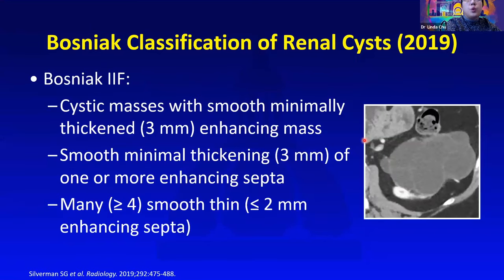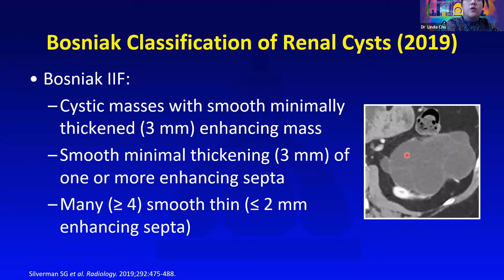For Bosniak 2F, the septations can be a little bit thickened, or there is minimal thickening of one or more enhancing septa, or many smooth thin septations. Something like this would fall into Bosniak 2F, in which you have more than four very thin septations.